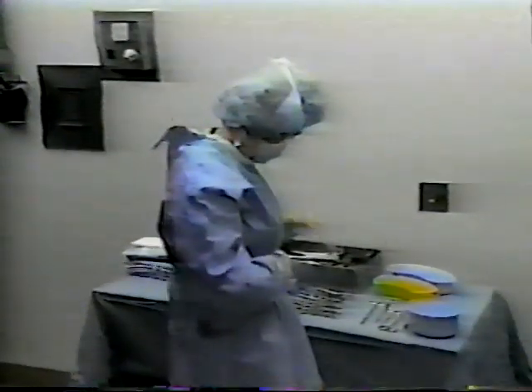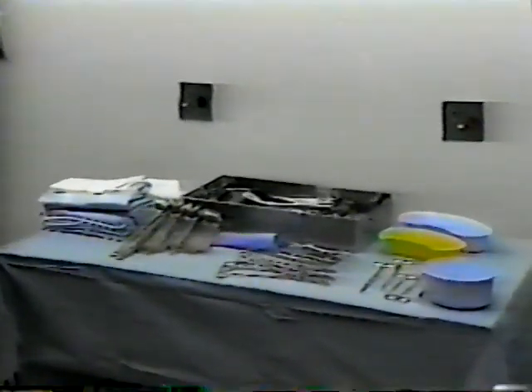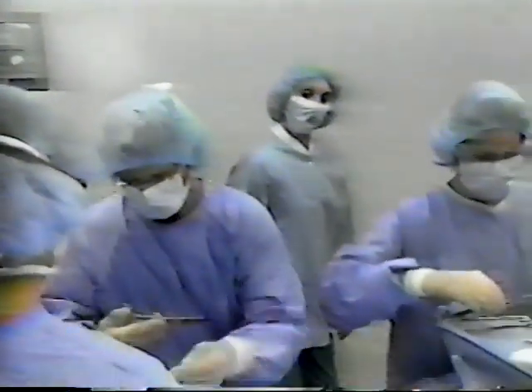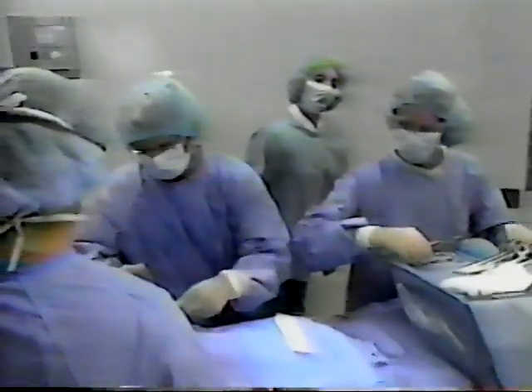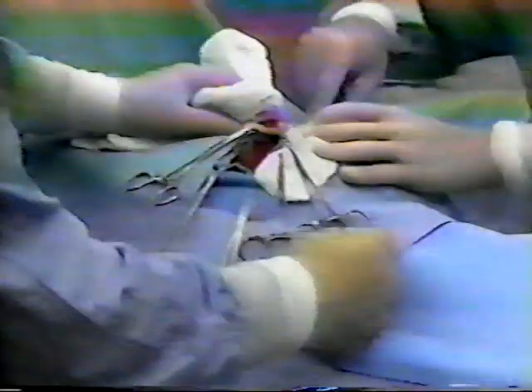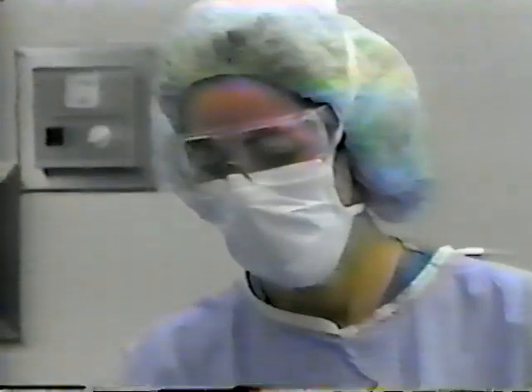Sterile fields should be prepared as near as possible to the start time of the surgical procedure. A sterile field must be constantly monitored. Unguarded fields should be considered contaminated. It is the responsibility of all members of the surgical team to maintain a sterile field. Operating room personnel must acquire the knowledge and develop skills needed to control their environment. They also need to have the surgical conscience to continuously apply these basic concepts and principles.